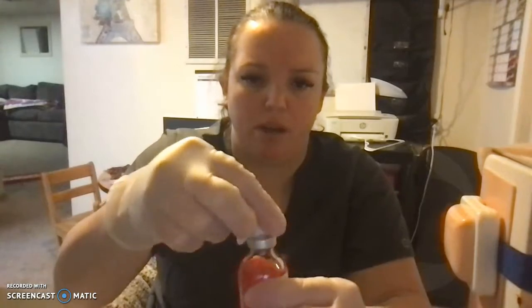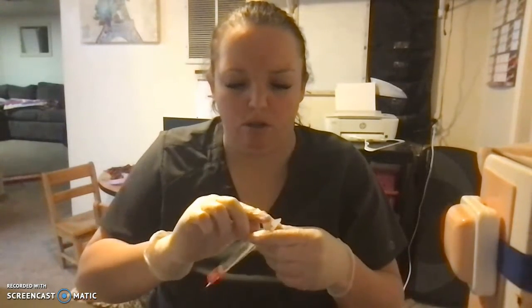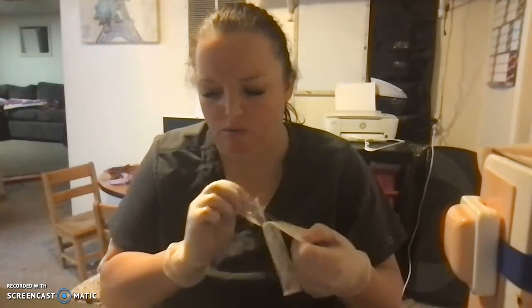Okay, so first I would start by cleaning the top of my bottle with an alcohol swab to avoid contamination. Next, I would open my needle. Actually, before I do these, I'm going to assess my patient's skin. So this is going to be my patient's abdomen, about 2 inches from the umbilical area. Ask my patient which side that they had their last injection on, because I want to rotate sites and not do it on the same side every time.